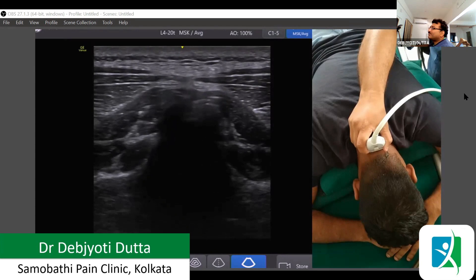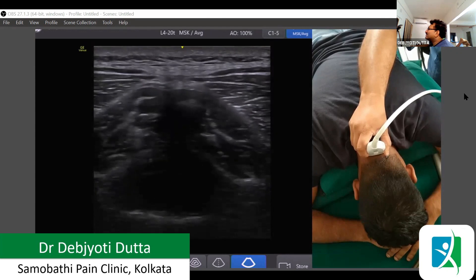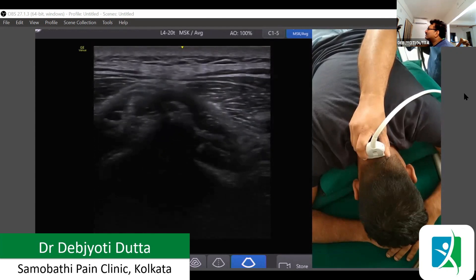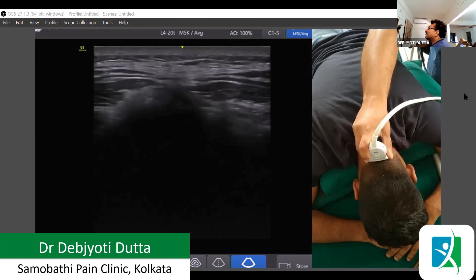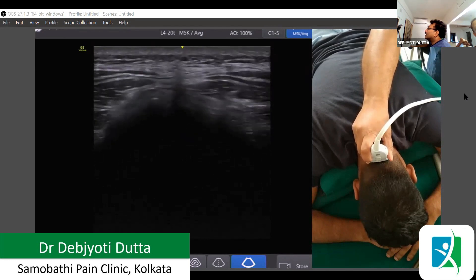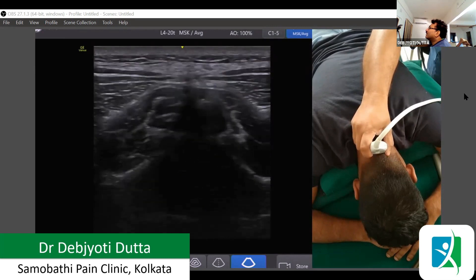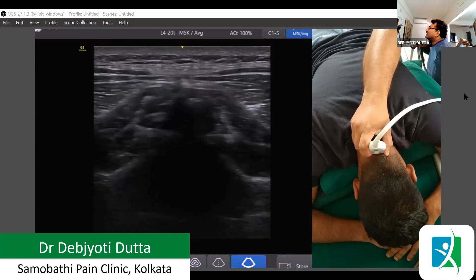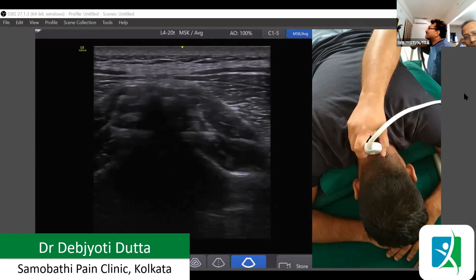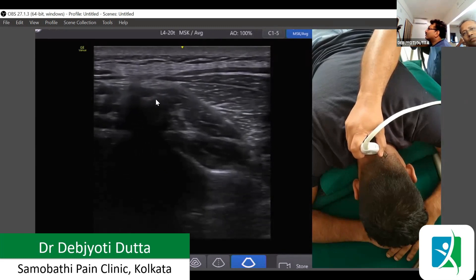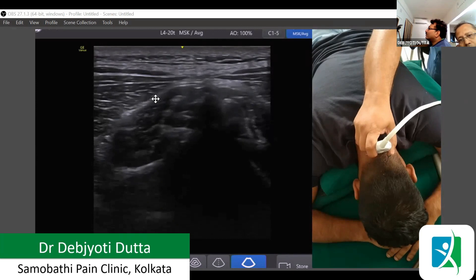We are looking at the bifid spinous process. Once we identify it, we re-examine to confirm it is the first one, otherwise it may not be the correct area. Coming from above downwards, we can see the muscles on both sides. This is the bifid spinous process — to the right side of the patient we can see the obliquus capitis inferior, and on the left side we can also see the obliquus capitis inferior.